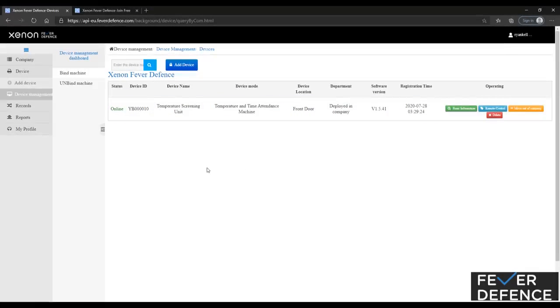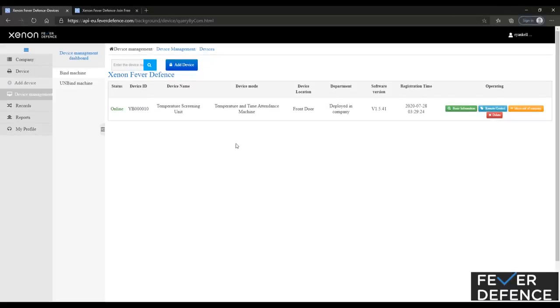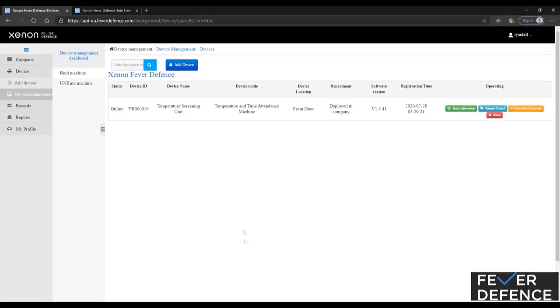So from there, you've added your device, and your cloud platform is up and going.